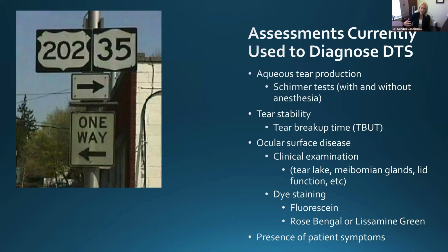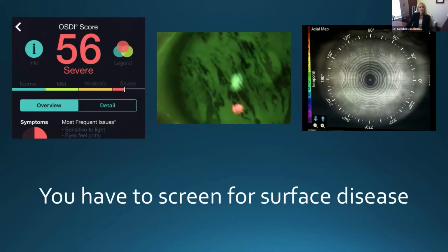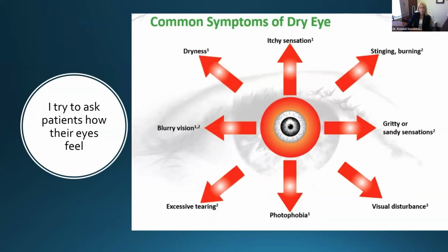But not everyone wants to spend the money on some of those devices, so there are cheaper ways to do that listed here. But it begins with the actual exam on the patients. Certainly we see here the irregular fluorescein staining. I really still like two-dimensional devices like we see here with the Placido imaging on the right. Those Placido rings are irregular, indicating ocular surface disease.